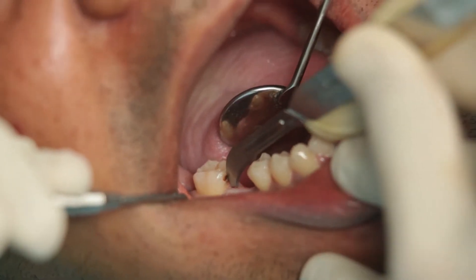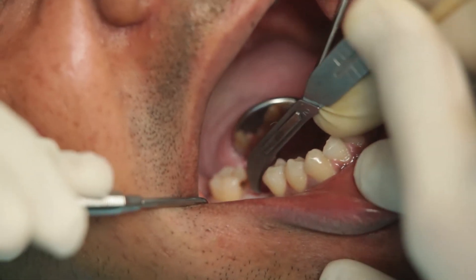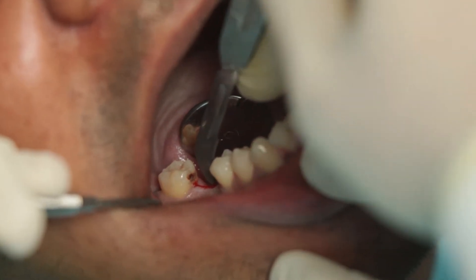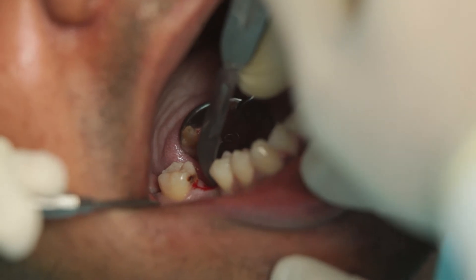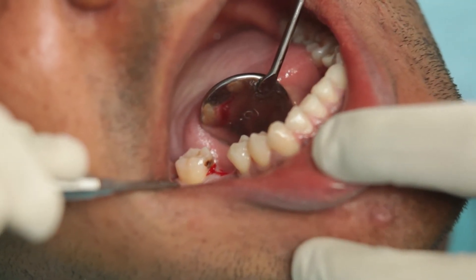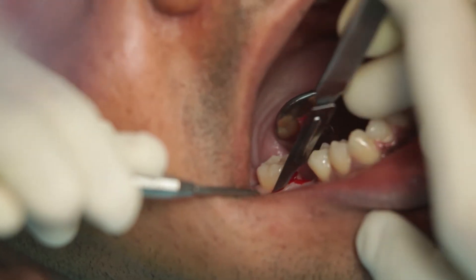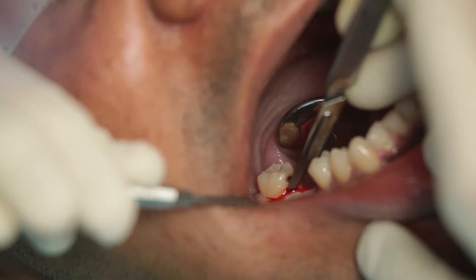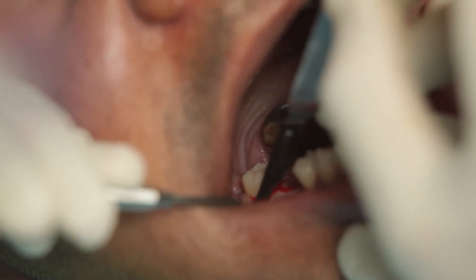It's time to start with the incision. In this case I am using a number 12 blade to get proper access to the site. This is my crestal incision, which needs to be right up to the bone in a single smooth stroke. I will also use crevicular incisions both mesial and distal to the operating site. I could either use a 15 or a 12 number blade to accomplish this.